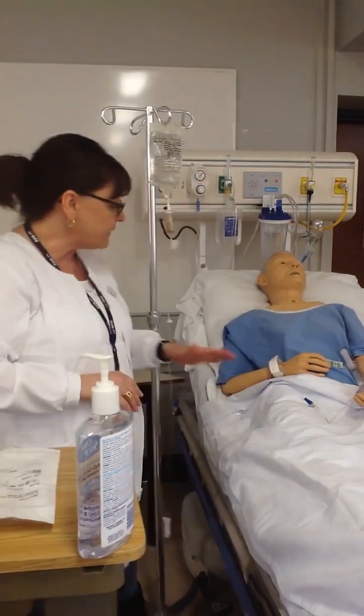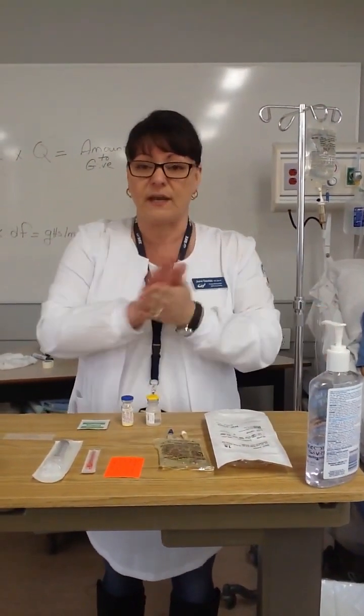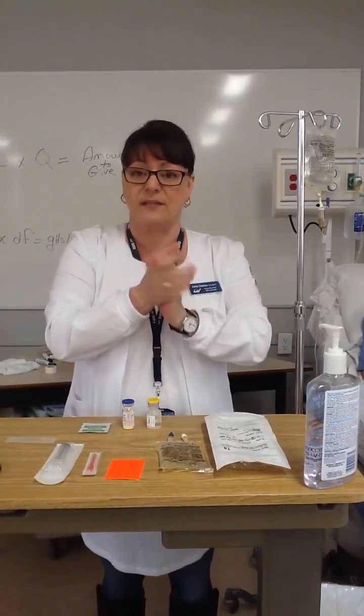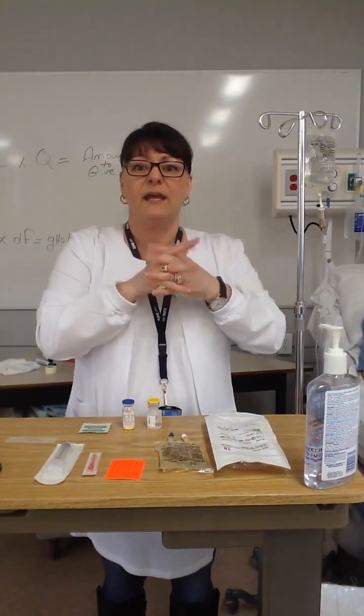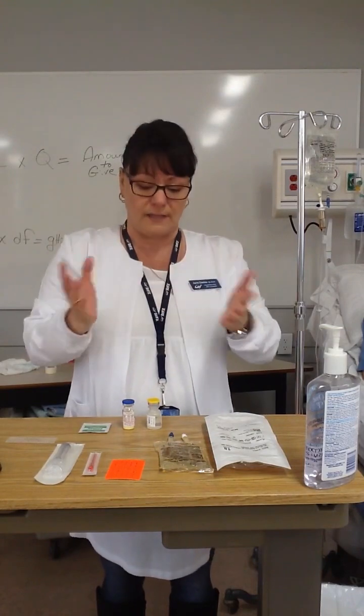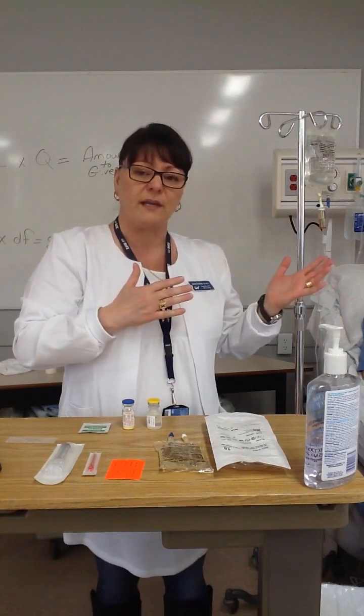When I'm happy with all of that, now I'm going to come back to my medication room, wherever that preparation is taking place. I'm going to perform some hand hygiene. I'm going to make sure that I have assembled my supplies on a clean surface. Everything we do should be aseptic and or sterile whenever it applies, so that we reduce the chances of our patient developing any kind of infection.